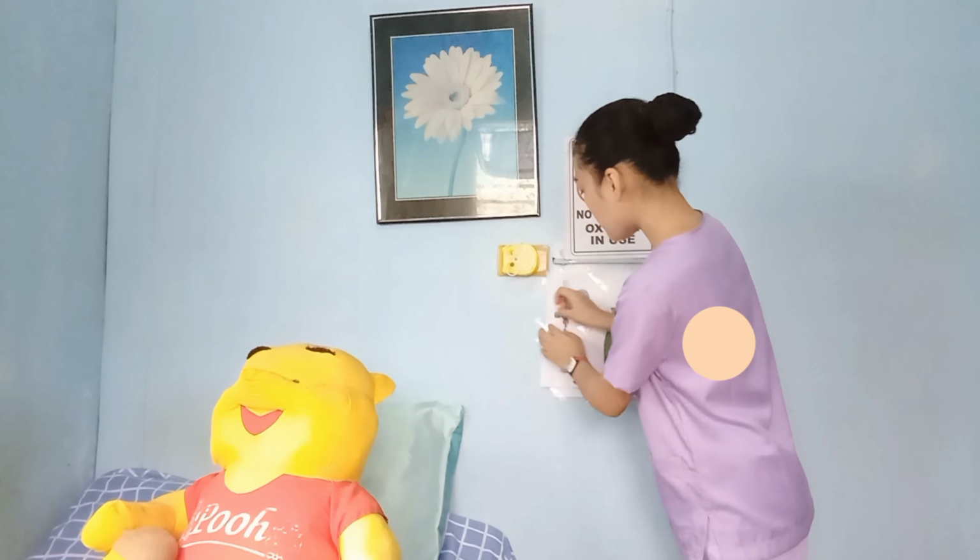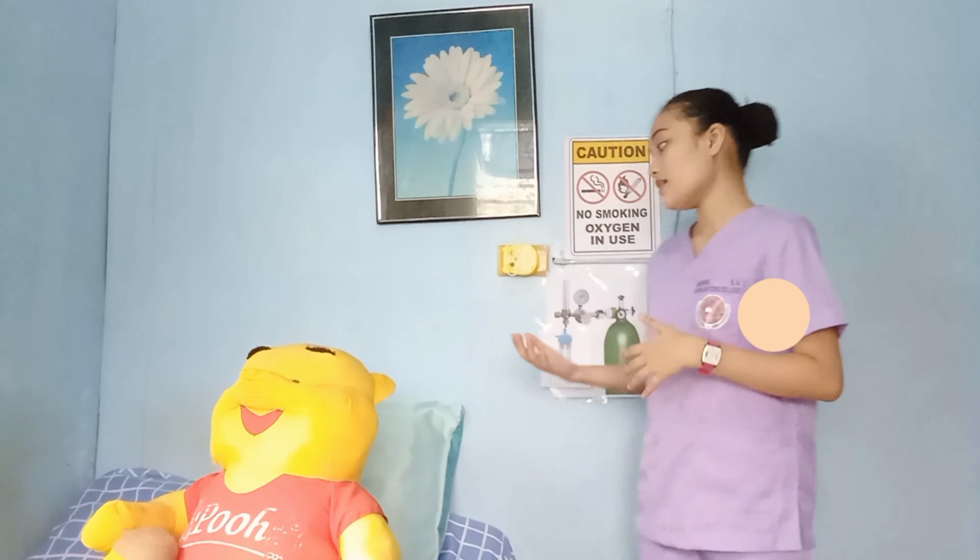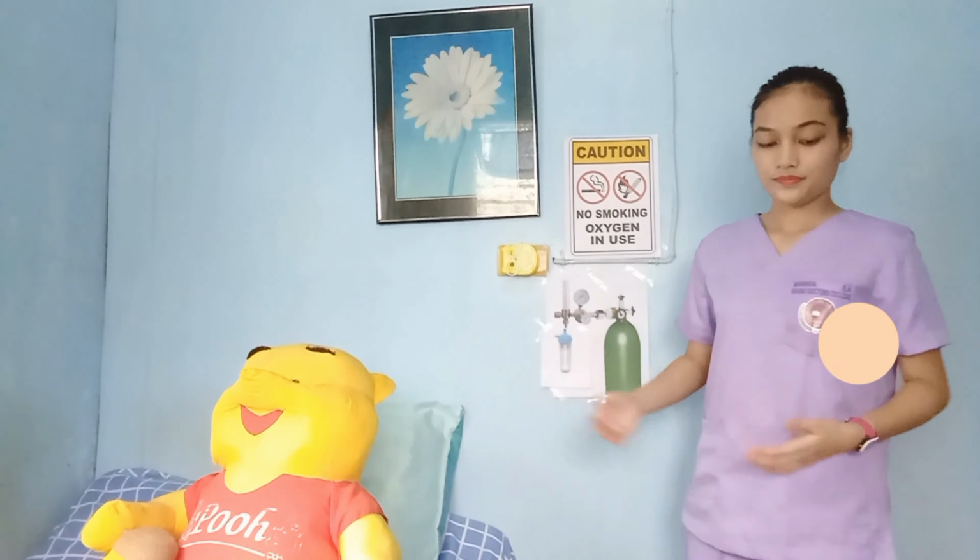This is important because sometimes when we administer oxygen, this could cause drying and irritation of the nasal mucosa. And to prevent that, we have this humidifier.